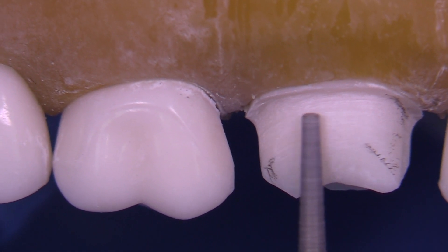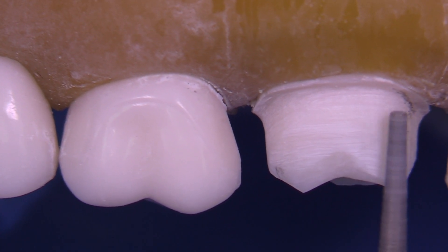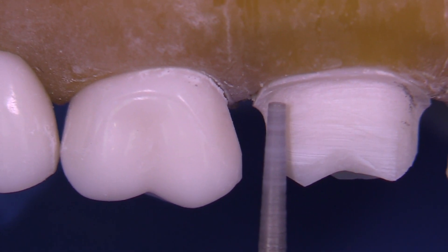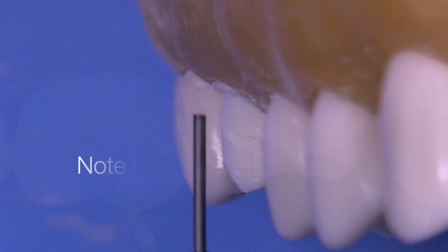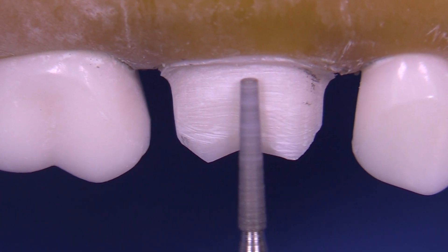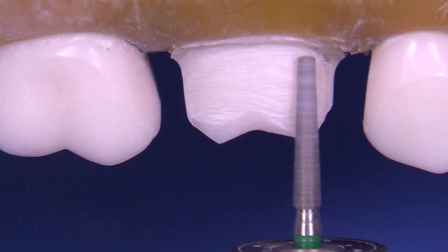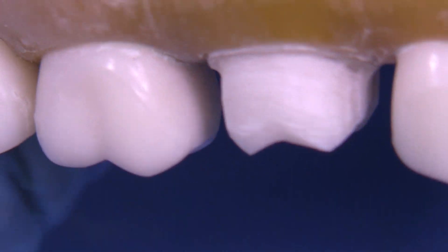It's just a matter of managing it once you create it. The key is not to forget to remove the bulge above this area — it makes sense, because if you want one to 1.2 millimeters down at the gingival, you're going to need progressively more metal opaque and ceramic above that for a nice-looking PFM. So just keep removing the bulge above the undercut to solve the problem. Once you create the shoulder, you create an undercut — go back and remove the undercut. That's the key.